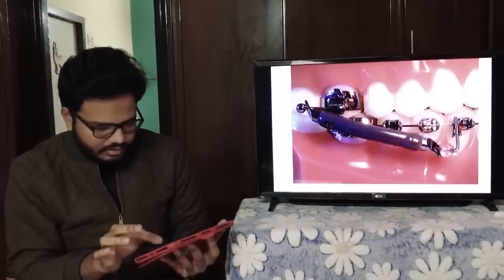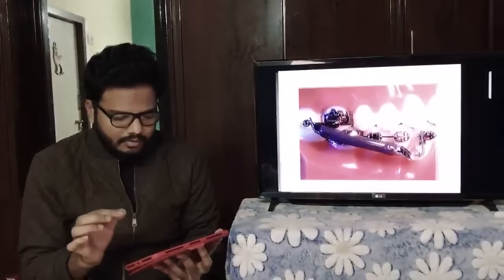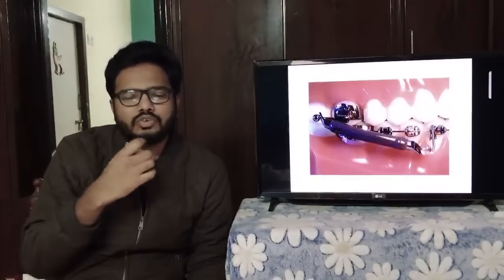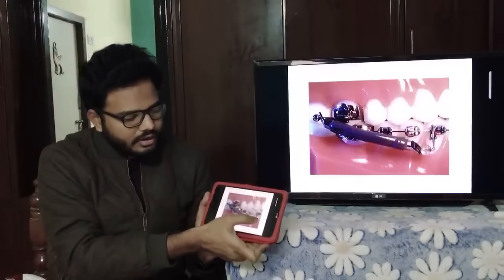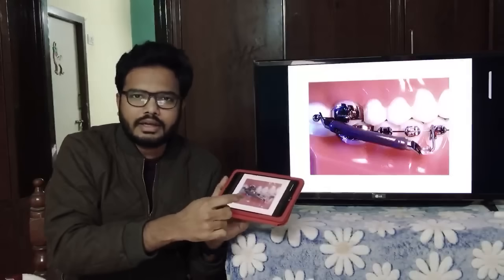It's this particular ball, if you can see, right? It's called a Lexan ball. It's a myofunctional appliance. Good. It's indicated in class 2 malocclusion, where there is maxillary excess with mandibular deficiency. We measure the distance between this molar and canine, the Lexan ball, and then add 12 to the value we obtain. We select a corresponding force module and place it here. During occlusion, since the force module is longer, it bends, creating a mesial force in the mandible and a distal force in the maxilla, right? This is nothing but, as you all rightly mentioned, Jasper jumper. Jasper jumper. Good.